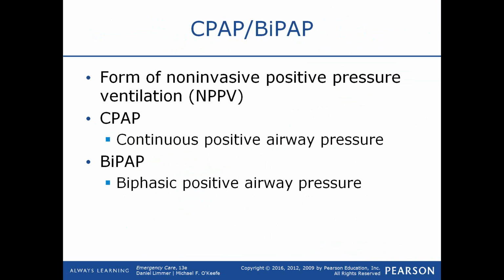The importance of providing pressure on exhalation is that if the patient has to breathe against pressure, it stents their alveoli open so that they can exchange more gas and get better oxygenation altogether.